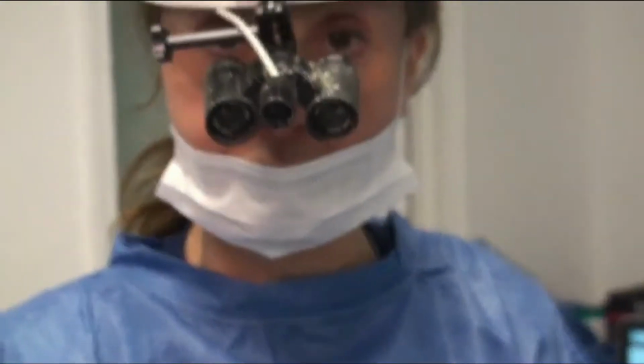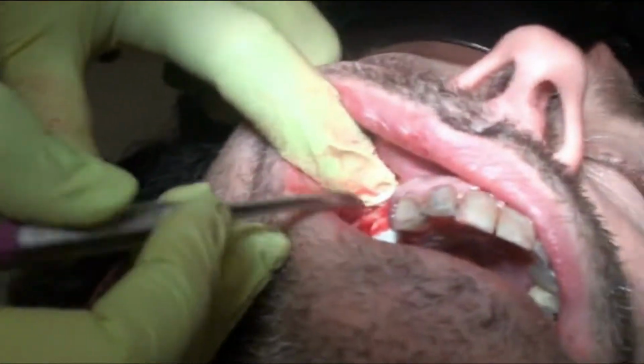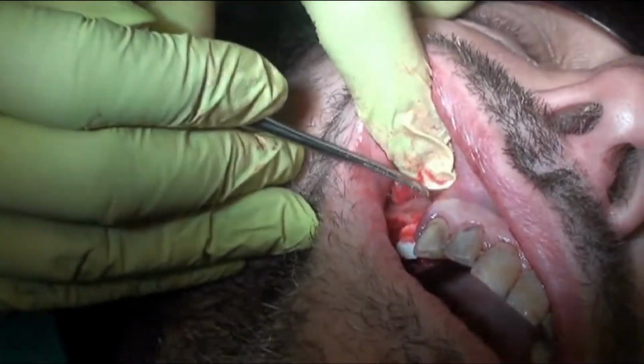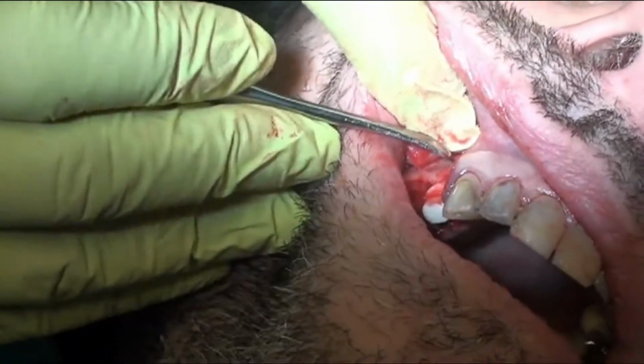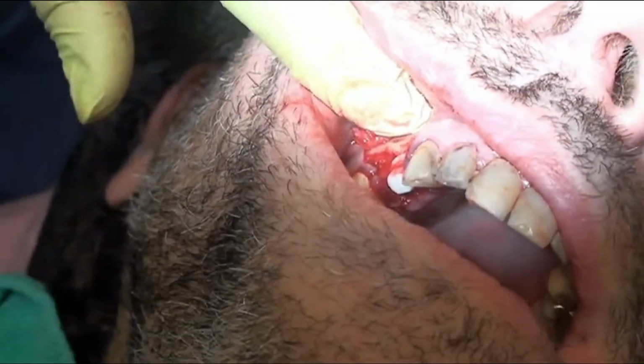We place one set of root implant 16. With one implant, we can get two premolar teeth. Then this hole where the tooth was infected, the bone was infected, I'm going to pack this with bone graft and his stem cells. Suture up, then we are done. We wait 3 months. Done.